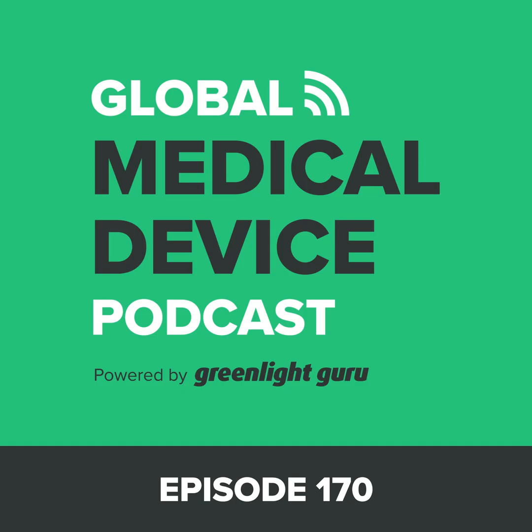I think FDA reviewers are busy. They're going to be looking through the document quickly, and it's really good to have that visual representation of how does information move through the device. What inputs are you taking from the environment, or from patients, or from databases, or from physicians, or from diagnostic tests? What are those inputs into the device? How does information flow through it? What modules or algorithms are involved? And then finally, how does it get put together and output? What does that output look like? What is it when it ends up going back to the user? How does it impact the clinical workflow? And I guess that last piece is outside the software architecture and is something different. But all of those previous pieces, they all flow into the software architecture.